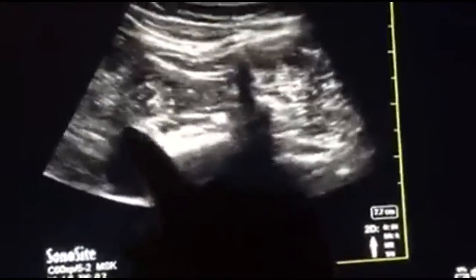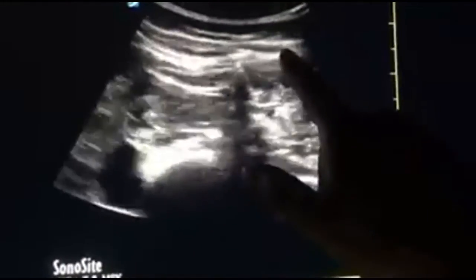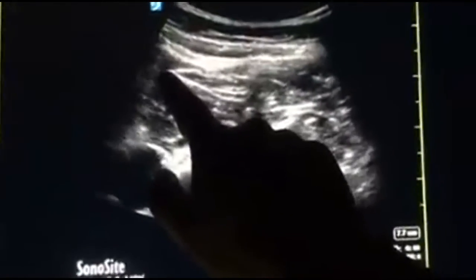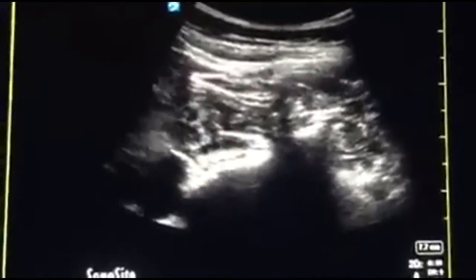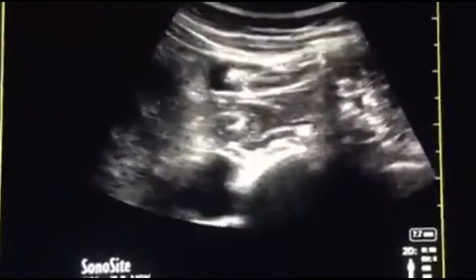This might be left or right side, depending upon the aorta or inferior vena cava. Okay, so my needle is coming there, and this is the anterior most part of the quadratus lumborum muscle, and after this it is transversalis fascia. So the needle takes me somewhere there. We'll go to the second video.